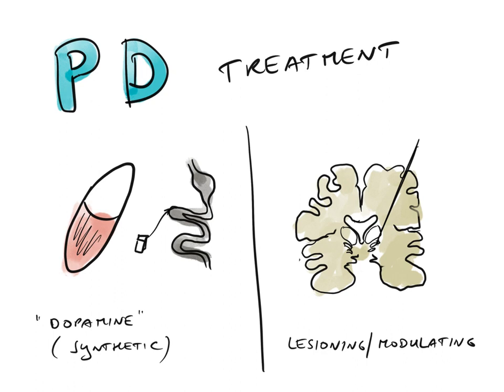If drug treatment isn't sufficient anymore, then intracerebral therapy is possible. Decades ago, the primary choice was lesioning, so damaging a piece in the brain. Then neuromodulation became available, which actually mimics the damage, but which is totally reversible, because high frequency stimulation in the brain mimics the effect that you could also cause with the damage. And now, very recently, new, safer lesioning techniques have found their way back. Besides radiosurgery, there's also the opportunity for focused ultrasound, which is still being explored, especially in unilateral cases, but it's one of the promising future options.